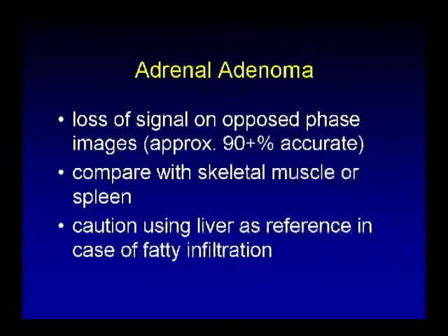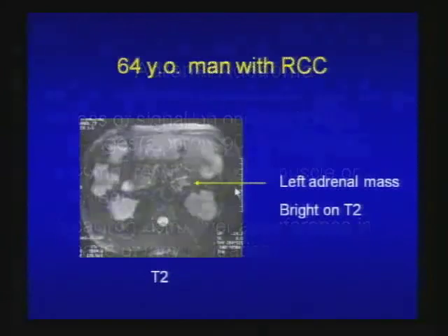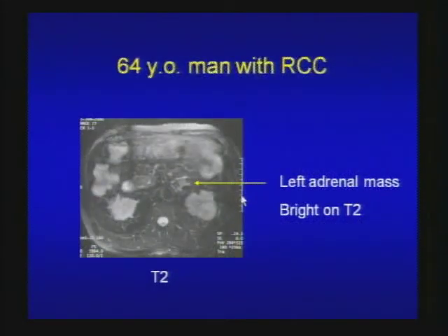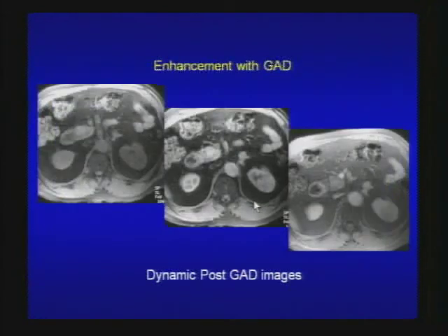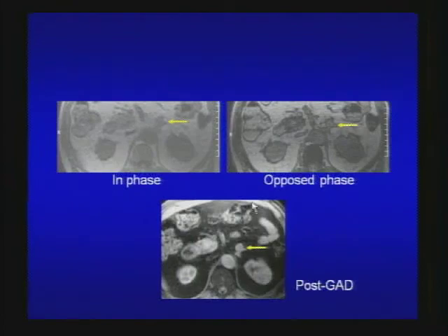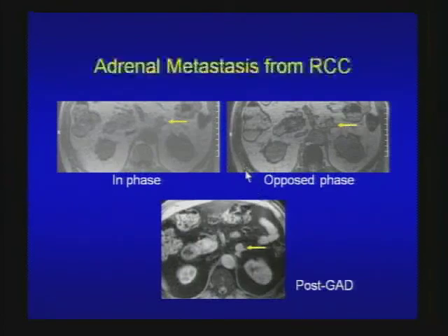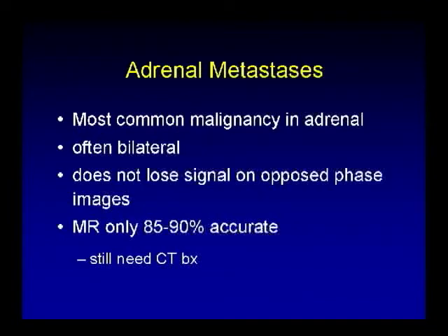Here is a 64-year-old man with renal cell carcinoma. Left adrenal mass — bright on T2, and on the opposed-phase images demonstrates no significant signal loss compared to skeletal muscle, so not typical for adrenal adenoma. Patient went on to get contrast-enhanced MRI showing the renal cell carcinoma on the left. In this patient with RCC, this left adrenal mass is metastasis. Adrenal metastasis is the most common malignancy in the adrenal gland, often bilateral, does not lose signal on opposed-phase images, and MR is only 85 to 90% accurate, so CT-guided biopsies are still required.